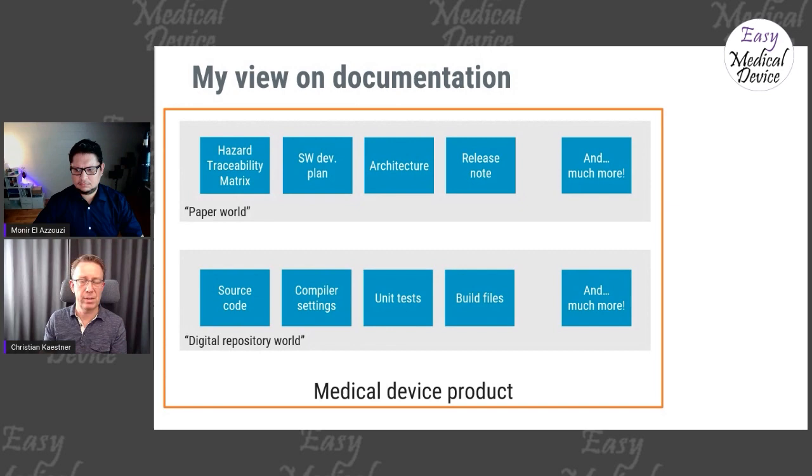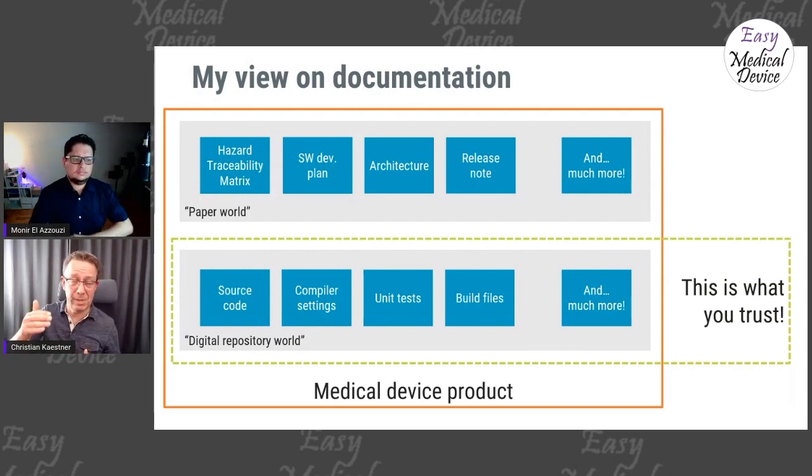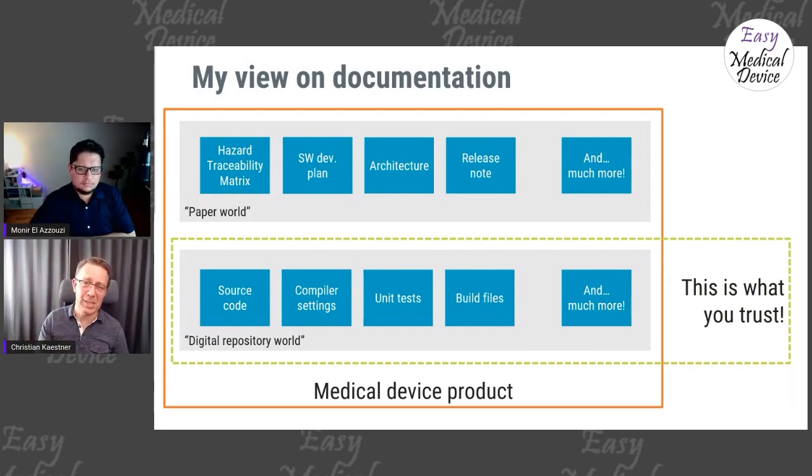So there's no product without documentation, and there's no product without the software. But the funny thing here is that there's very often a big trust in the papers, and people attribute the documents a very, very big value, perhaps even a huge value if you look at the number of signatures you can find on some documents.